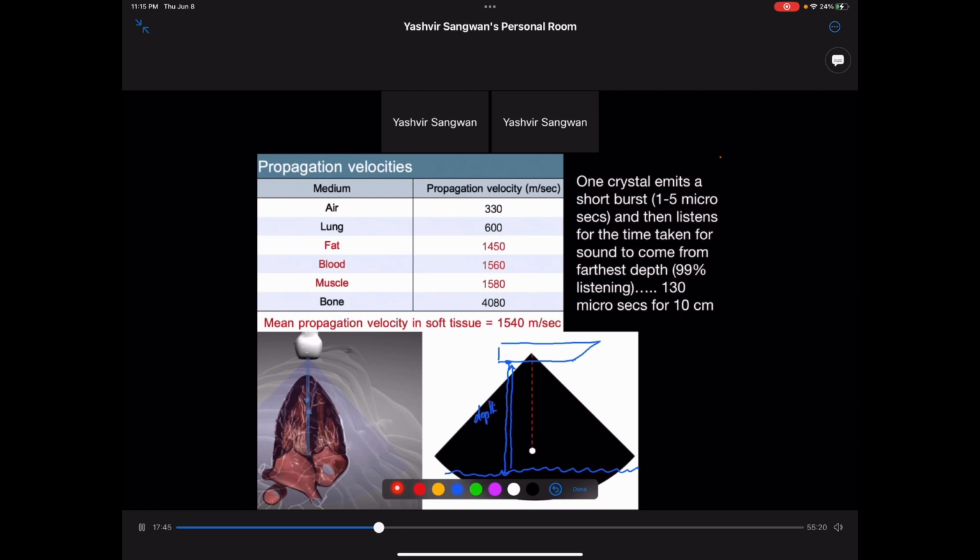Now imagine later on another sound comes in and then it gets reflected faster. That means it hits something here. And then maybe another sound will hit something here, and another here, and very soon you realize that you might be looking at a big fish. On the other hand, you might have a sound hit here, here, and here, and you might realize you are looking at a sunken submarine. Water has a constant speed of sound, so by looking at the amount of time, distance can be calculated.